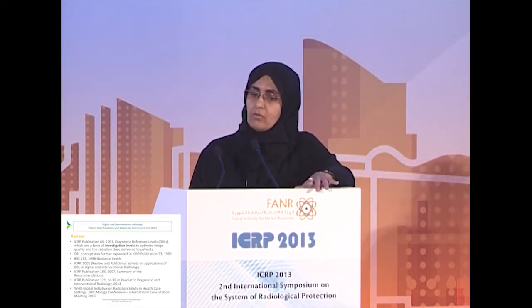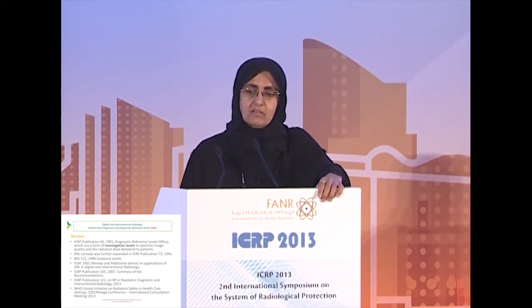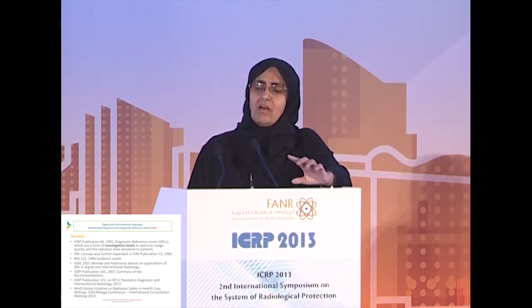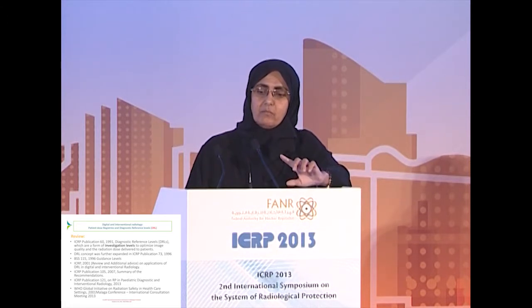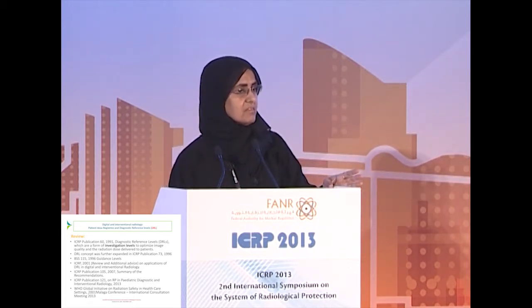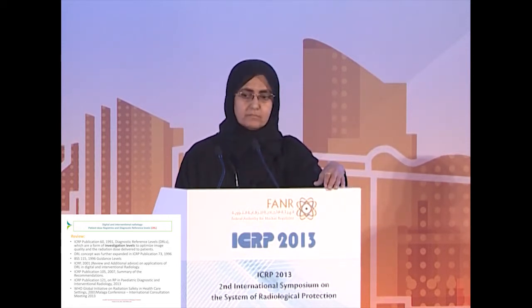I will not go over all this, but as you see, from 1991 till very recently, meetings and recommendations are published and gathered on this important subject. It started with publication number 60 in 1991, but in some countries this was established well before that, like in the UK, where it started in the early 1980s.